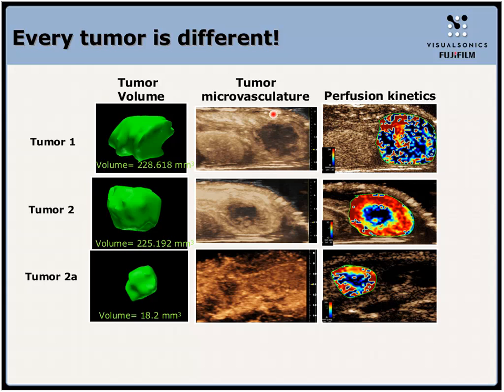microvasculature. We looked at the tumor microvasculature using contrast-enhanced ultrasound, and also mapped the guts of the tumor using our VEVO software, which I didn't go into too much depth. And you can tell that two different patients' xenografts are entirely different in their gut. One seems to be well perfused in the periphery, not so much in the core, whereas this is very heterogeneous.